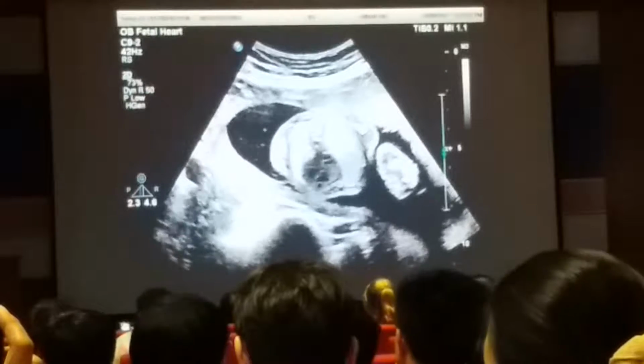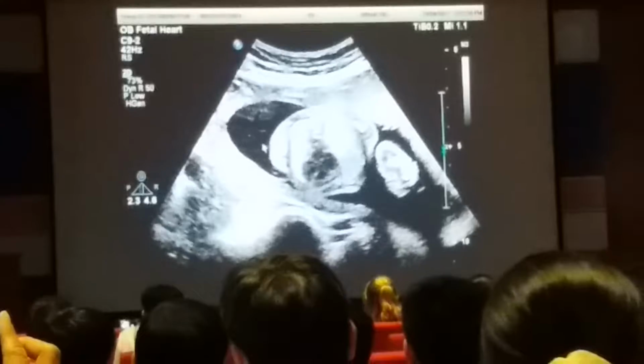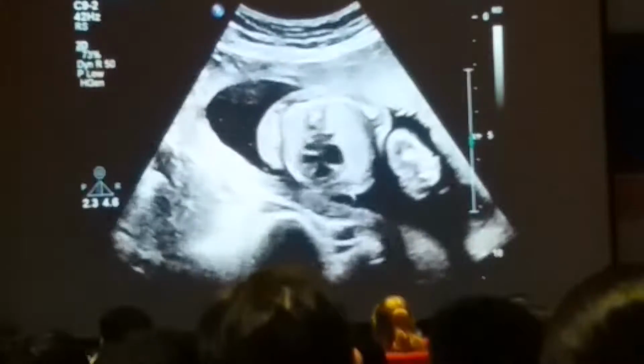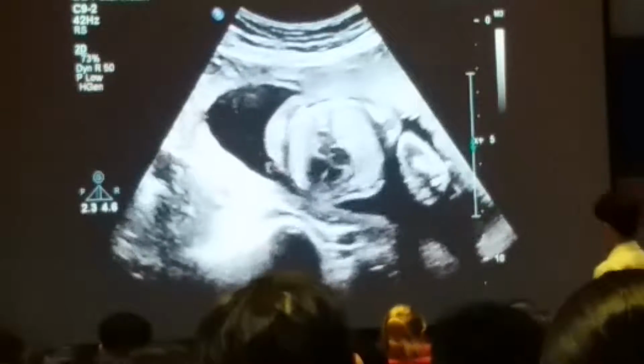Yeah, I'm going to zoom up on this in a minute, but I just want to show you spine. This is left side and right side. There's levocardia. Here's the sternum over here. So this is all the left side. Here are the pulmonary veins.